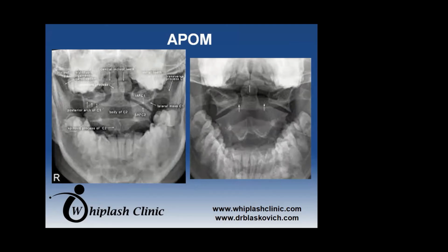So this is one of those things, because I showed you on the left-hand picture that the middle of the incisors splits the difference on the dens, so it should literally go down the middle of it. That will tell you that the head is probably not rotated because the two front teeth are not in the same space as the dens is. The dens is probably 4 or 5 inches posterior to the teeth. And so if your head is rotated even slightly, your teeth will not line up with the dens.